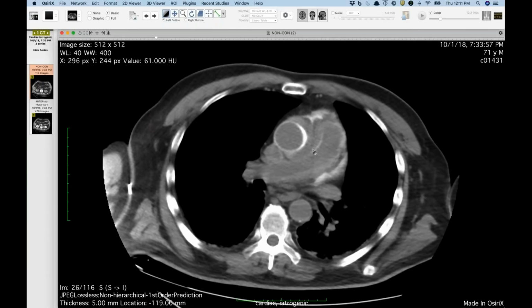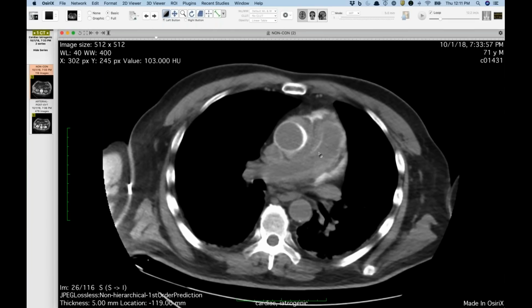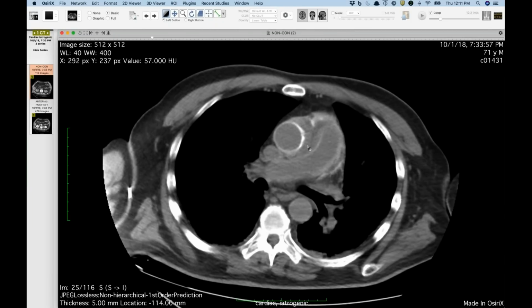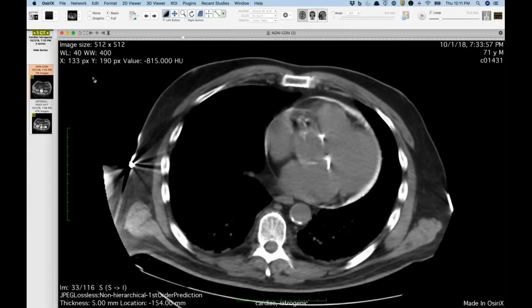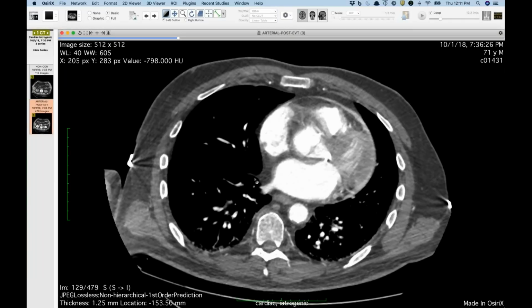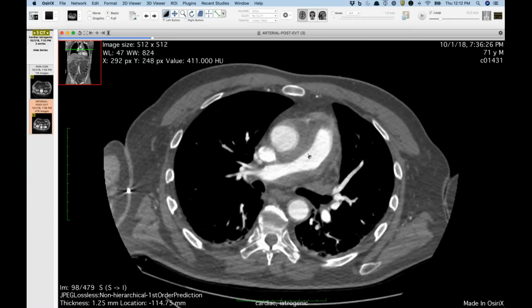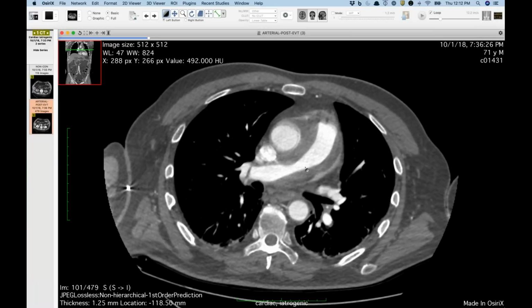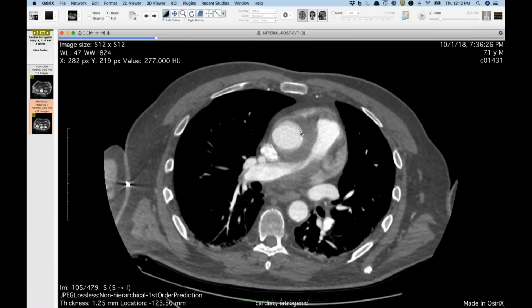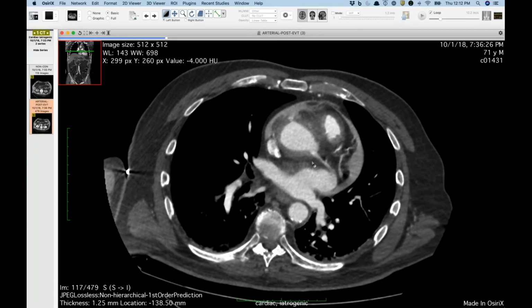What I think is really cool about this is the fact that you can see contrast accumulating along our shared adventitial space in the pulmonary artery, and it's basically intramural contrast along the ascending aorta. And then there is a post con here where you can just see the same thing, but it's impressive the injury that was caused, resulting in this shared sheath adventitial hematoma along both the aorta and the pulmonary artery. And of course, this is still that high attenuation contrast that's in the pericardial space there.